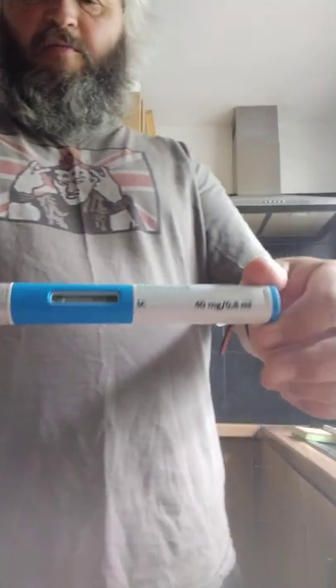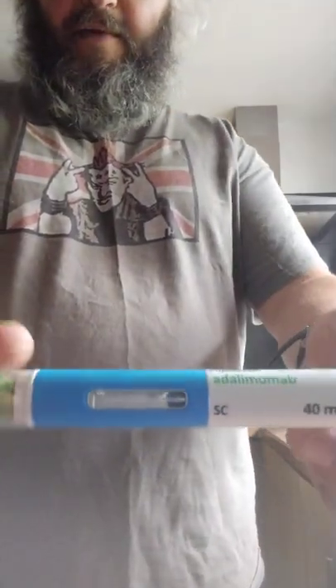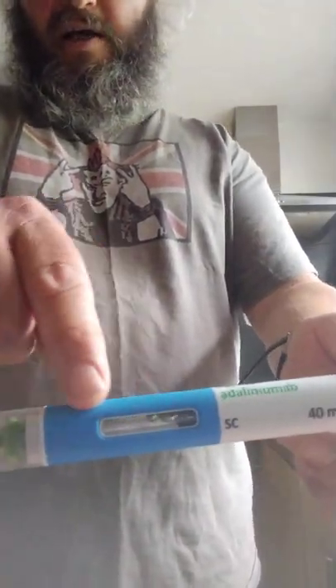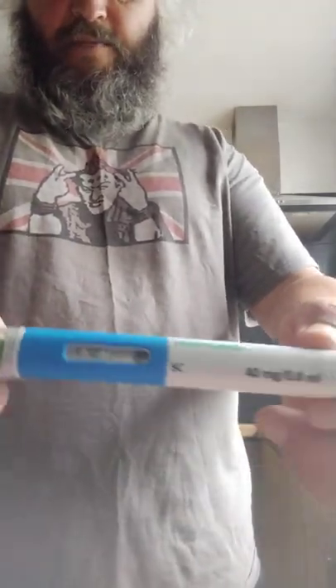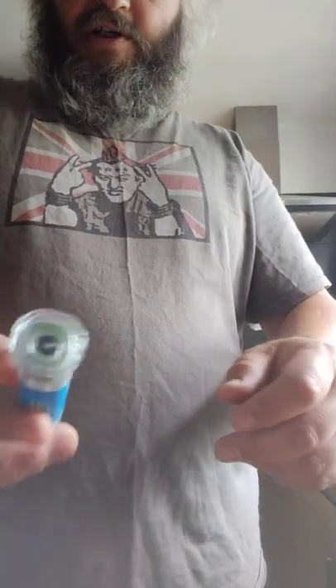This is stored in the fridge until time of use. This is the pre-filled pen — on it there's a little clear window where you can actually see the drug inside it. In preparation, open up one of the alcohol wipes.